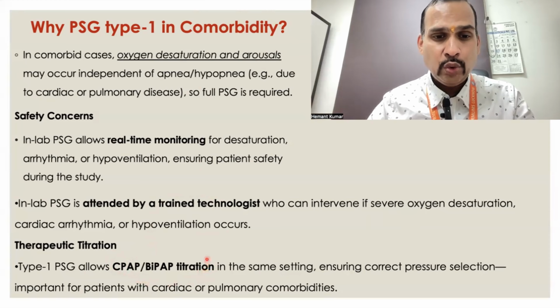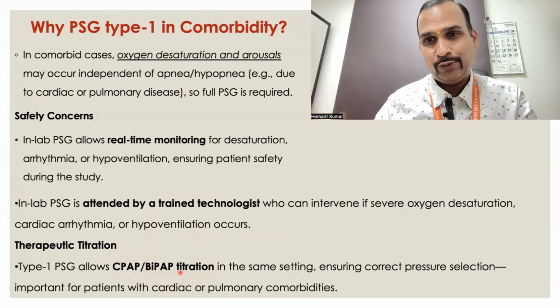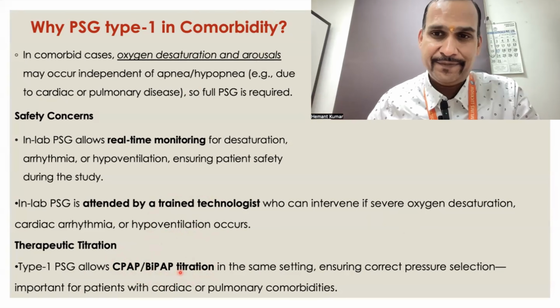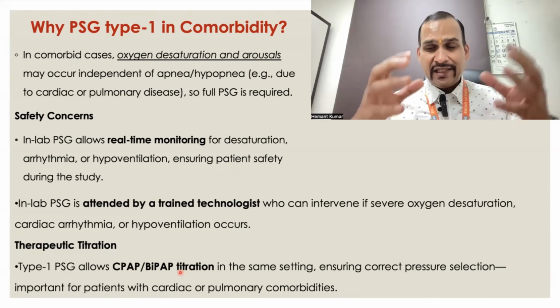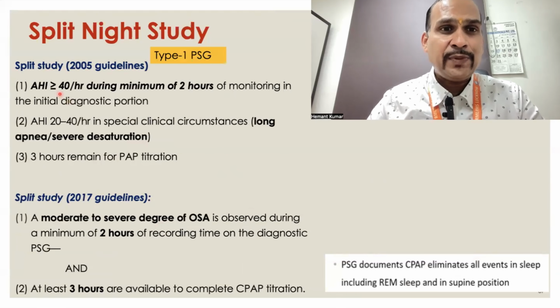So we can do the titration study with CPAP and BiPAP on the same day also. That's called a split night study. Okay. So in these patients, the only answer is a type 1 study. So what is a split night study?